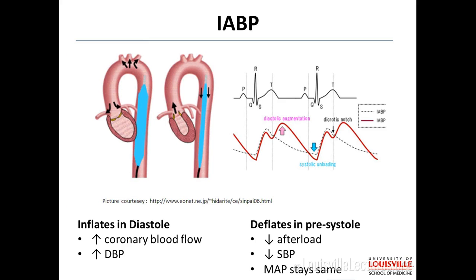So we will sometimes have them here at university in the CCU, depending upon the patient, and then over at Jewish we'll sometimes have them too. The idea of a balloon pump is it's just a catheter that has a balloon wrapped around it. And the balloon inflates during diastole and deflates during systole. So what that does is, in diastole, remember that's when the coronaries are perfusing. So when this balloon inflates, it blocks the blood, and so therefore more blood goes backwards and through the coronaries.